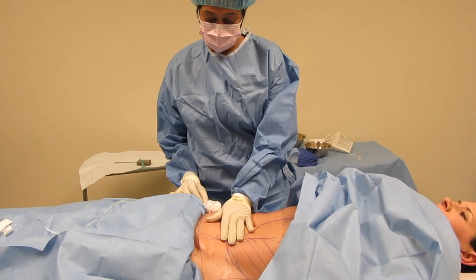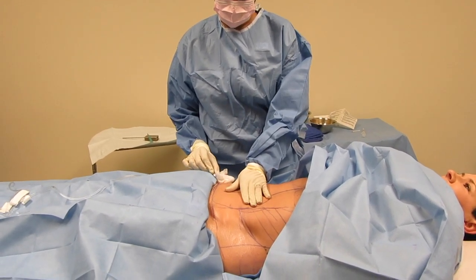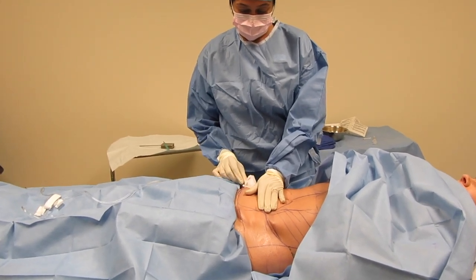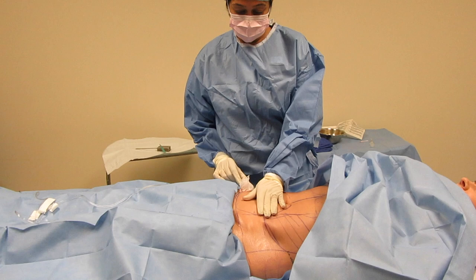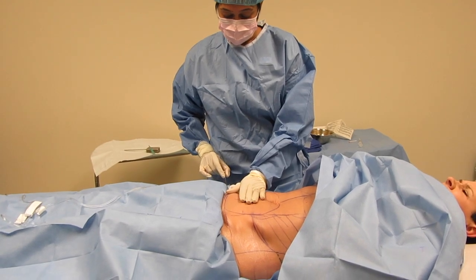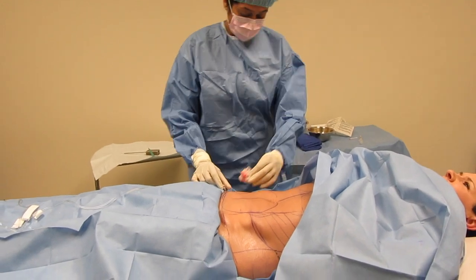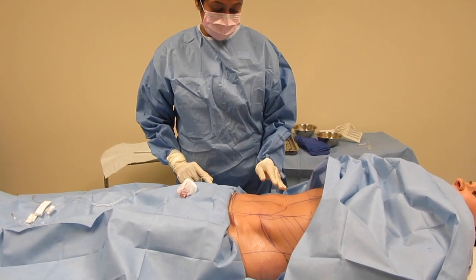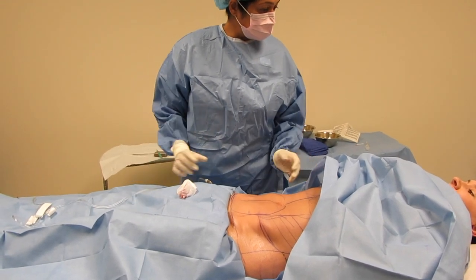So this is the first part. Numbing the area where we need to remove the fat. Nikki's tolerating it very well. There's one little zing here. Mm-hmm. Here. And then very quickly going on. In a newer area, you might feel a little bit more. As I said, we go very slow. So we're going to do this.